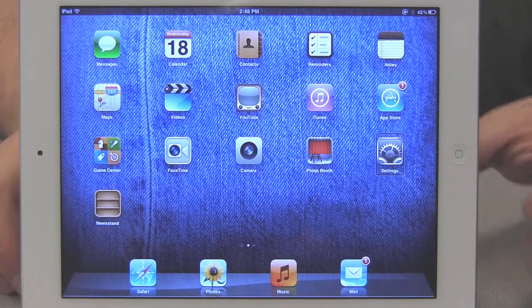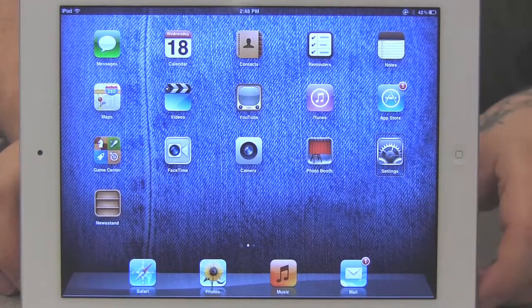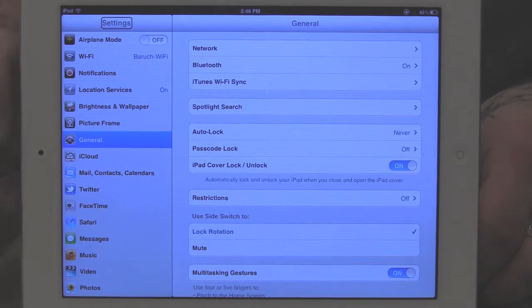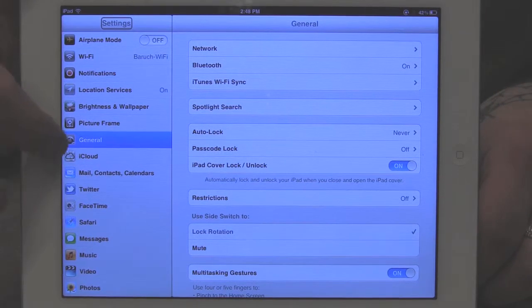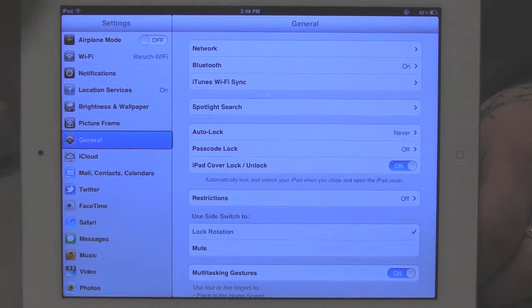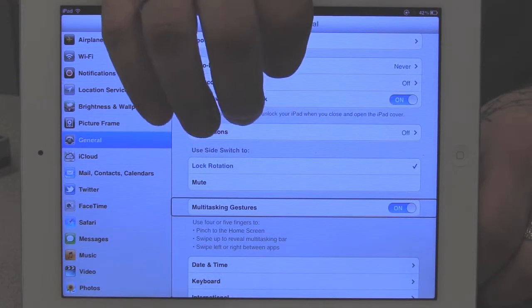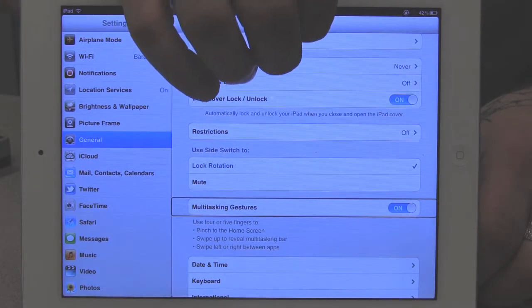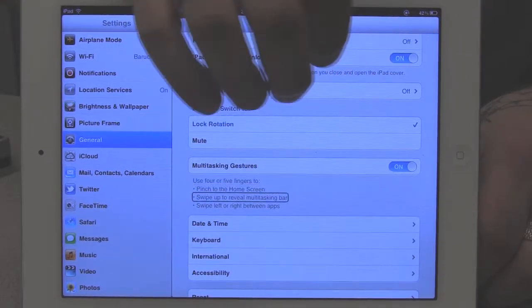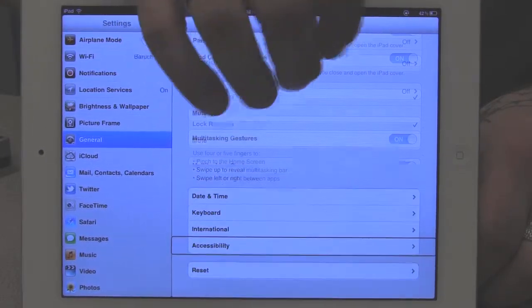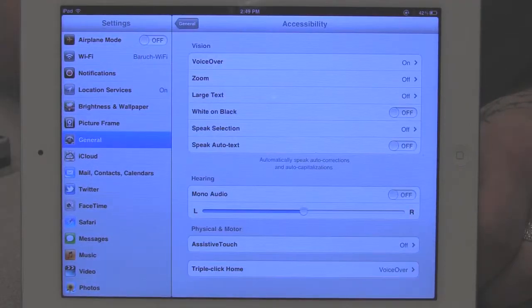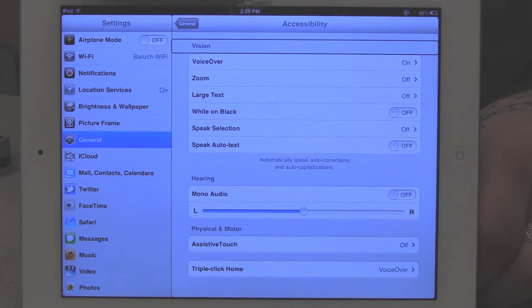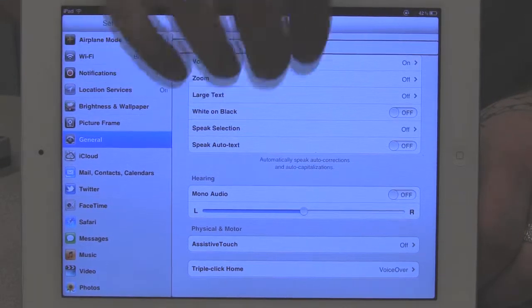We're going to go to Settings, and then we're going to make sure that General is selected. Then over here on the right side of the screen, we're going to go to the accessibility window. And then under the accessibility window, we're going to go to VoiceOver.